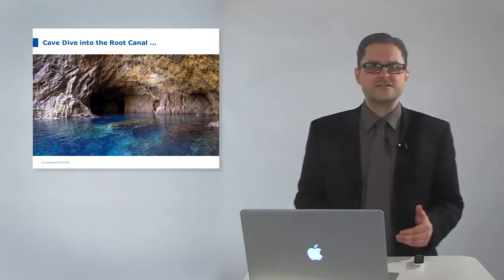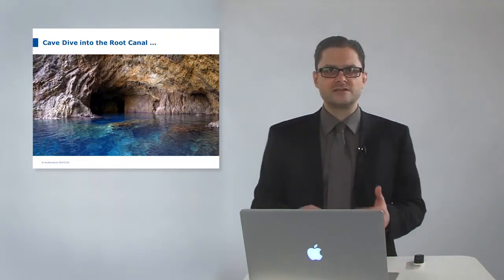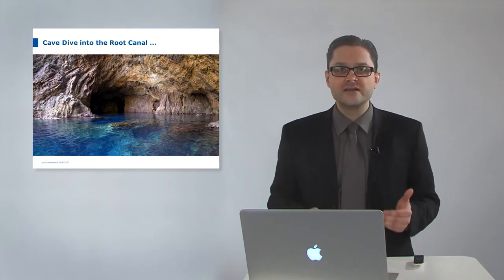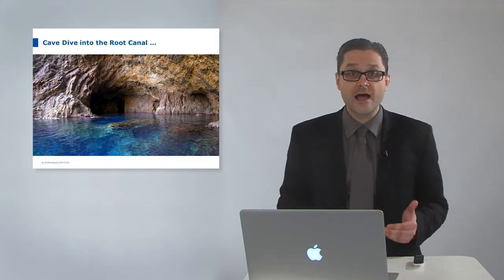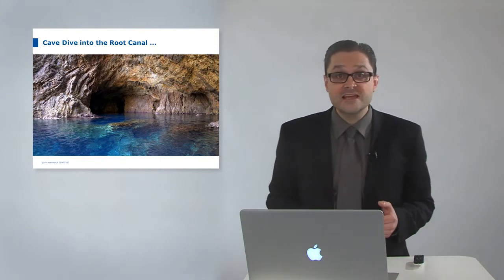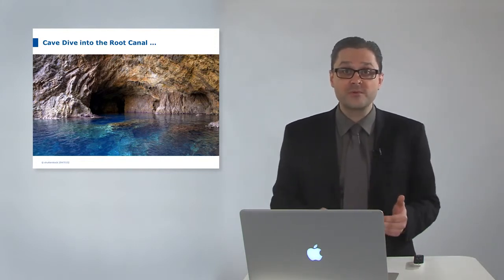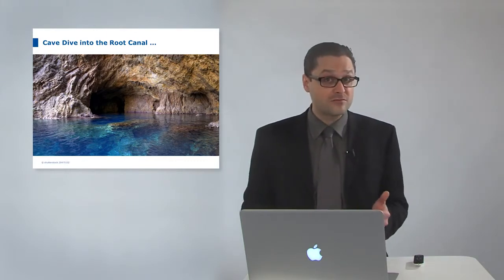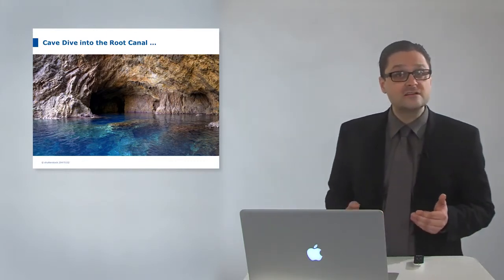Cave diving is the most challenging diving discipline. This is the same with the root canal treatment in dentistry. It is very hard work to find the tiny root canal access, to bring the endodontic file to the apex over the whole root canal length and to fill that hidden and small space properly. In addition, root canals can be very curved, very long and very tight.